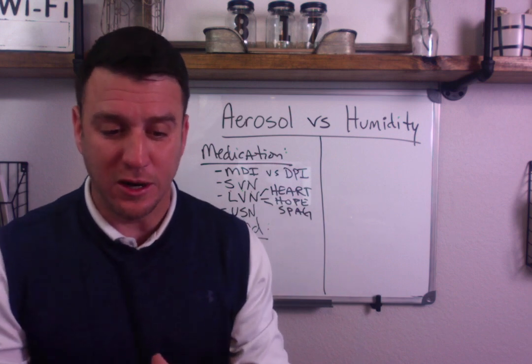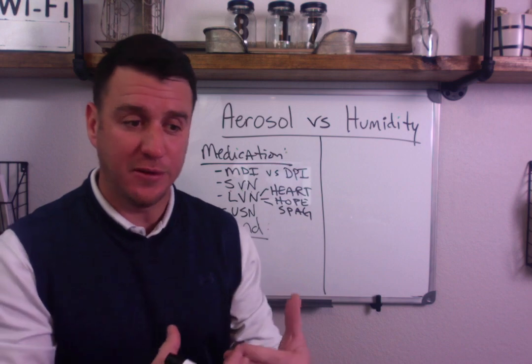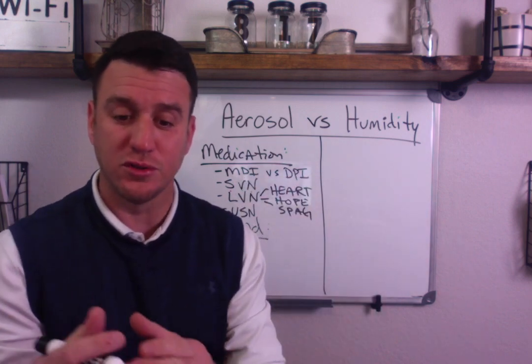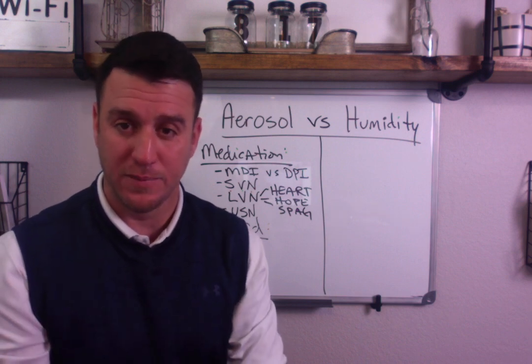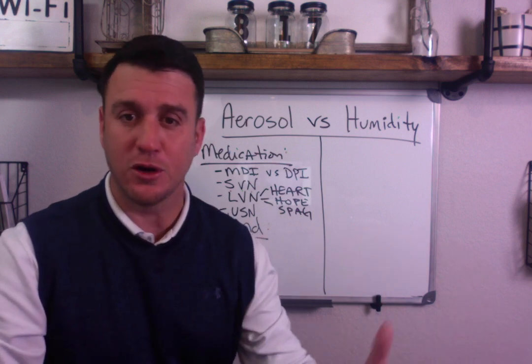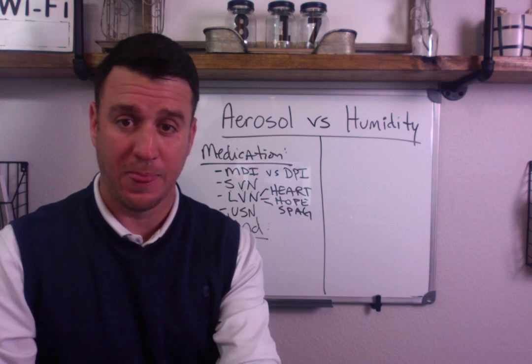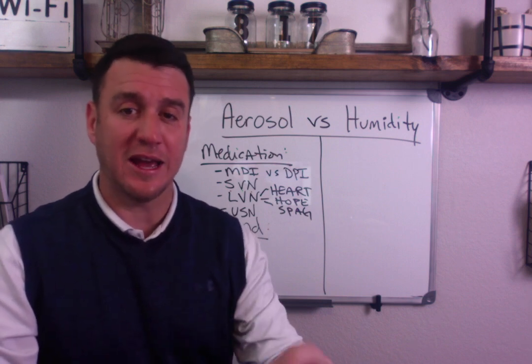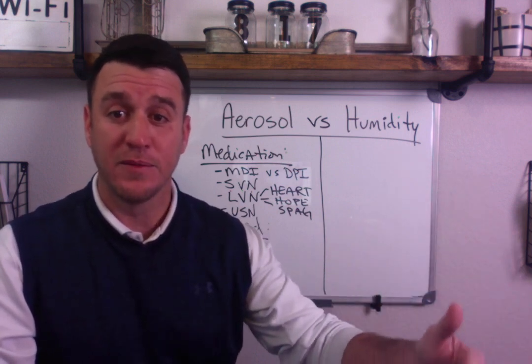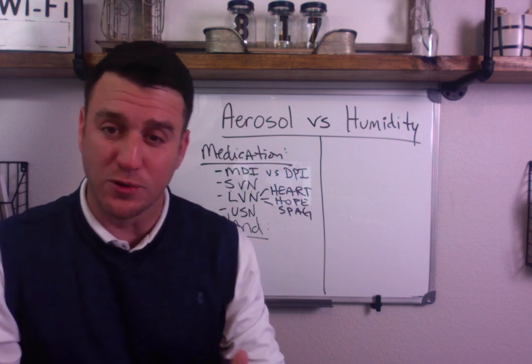Now here's what you need to know about the ultrasonic nebulizer. The output of the medication is directly proportional to the amplitude. So if a question asks you, how would you increase the output of an ultrasonic nebulizer, the answer is increase the amplitude. If the question asks you, how would you decrease the particle size of an ultrasonic nebulizer, then the answer will be to increase the frequency.